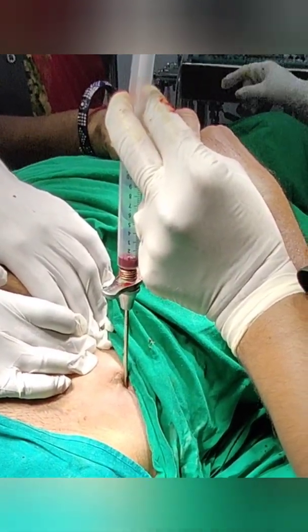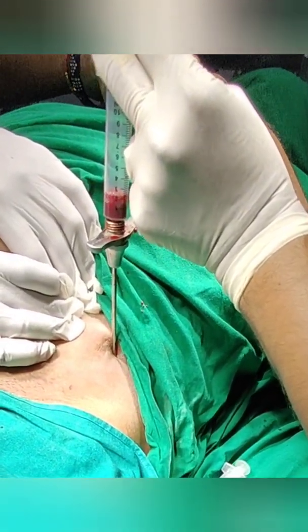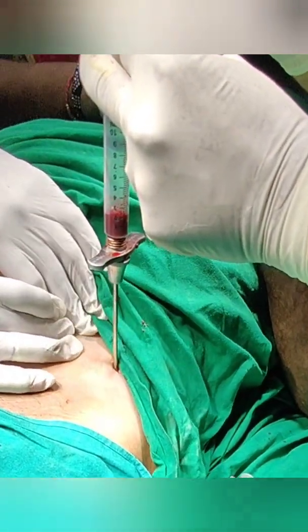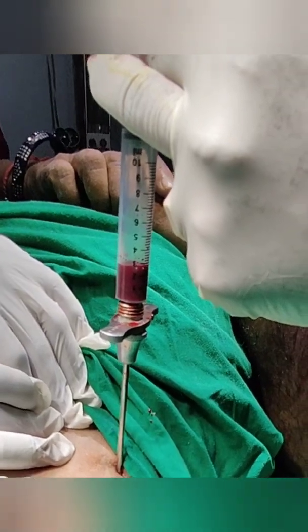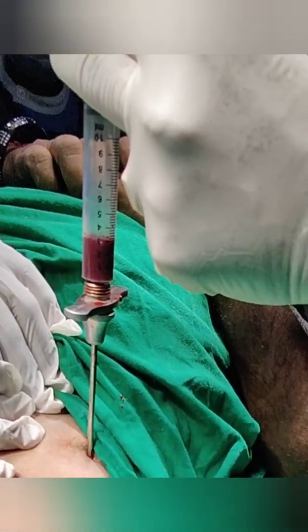The bone marrow aspirate clots very soon, so just ensure that after taking it out, directly put it inside the non-union site. Otherwise it may get clots. I usually take 25-30ml of this fluid.